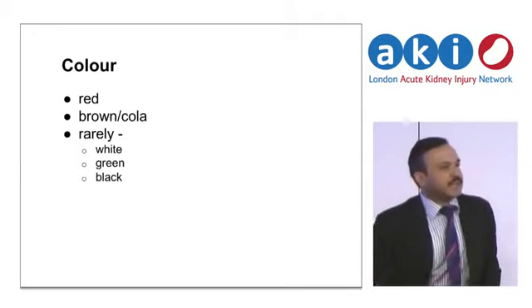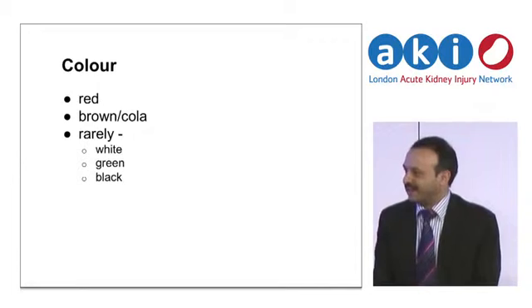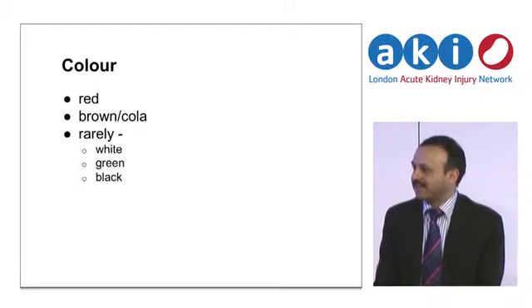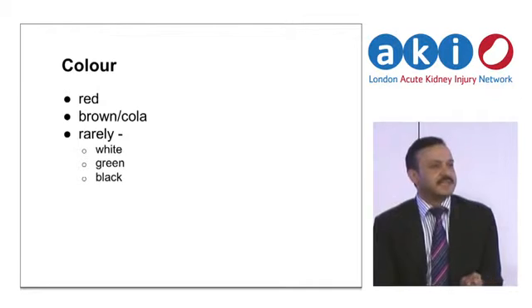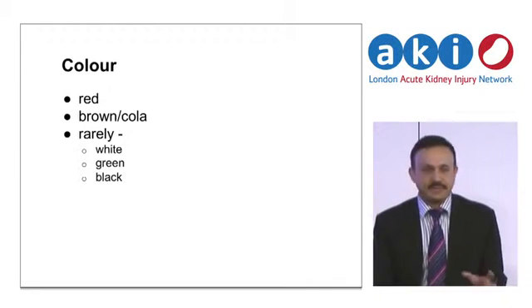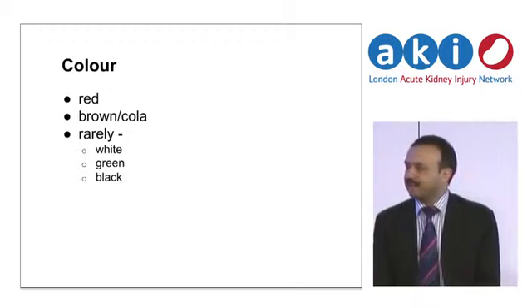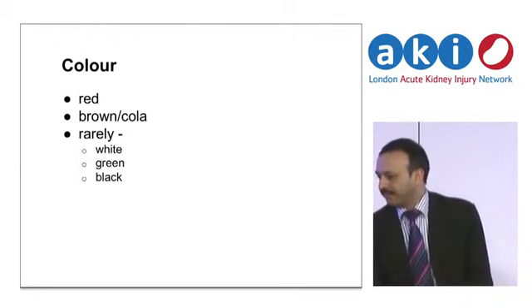So firstly, the color of the urine. Typically the color we worry about is red, and it's the most commonly reported color after the muddy urines which we see in catheters. The white muddy urine can be seen in patients with urinary tract infection if it's very pus cell-filled urine, but most of the time it is precipitation of phosphate crystals, which are white crystals. That's why catheter specimens can be very rich in crystals.